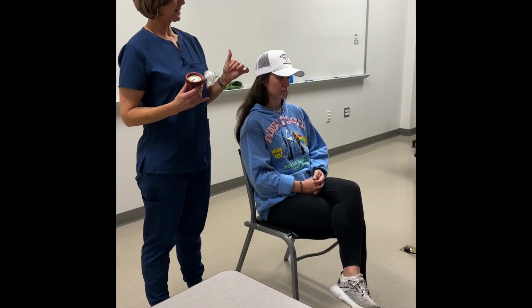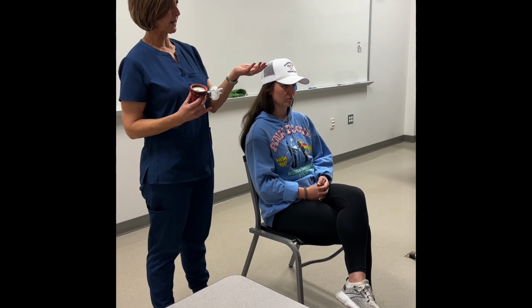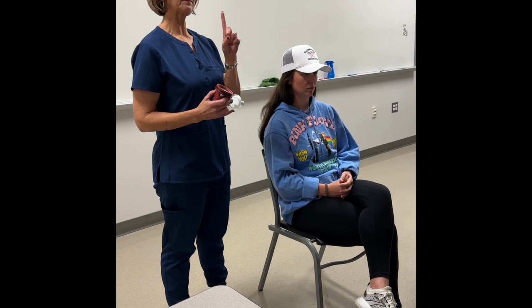With all your spontaneous pulmonary mechanics, minute volume has to come first. If you do your other ones, which take some effort, the person's minute volume will be higher. So you start out with minute volume. And like it says, you're gonna measure the volume for 1 minute.